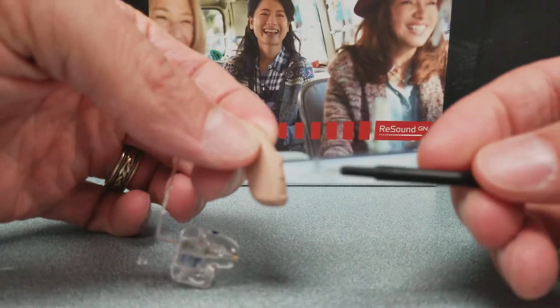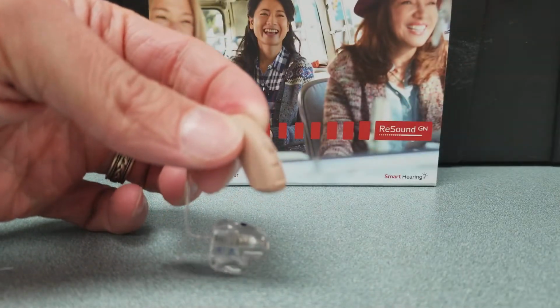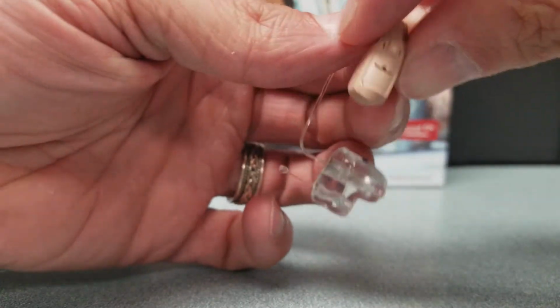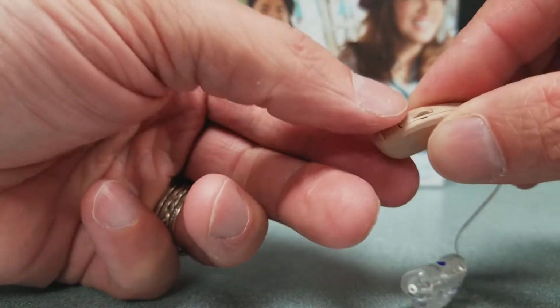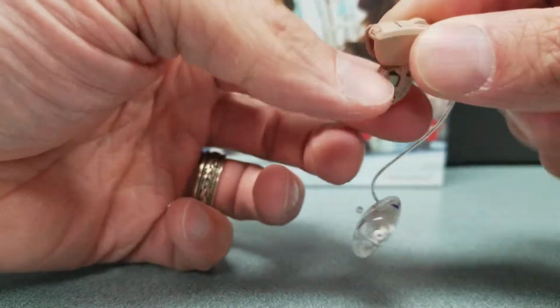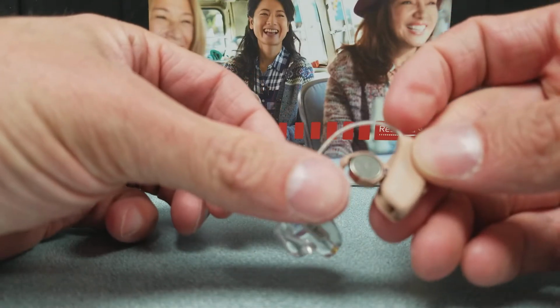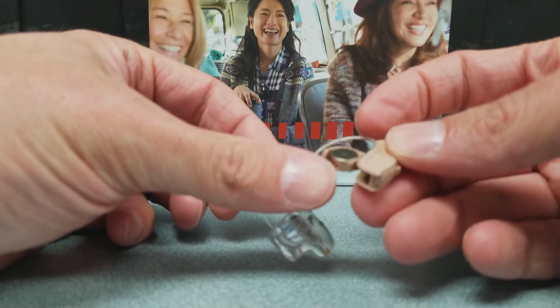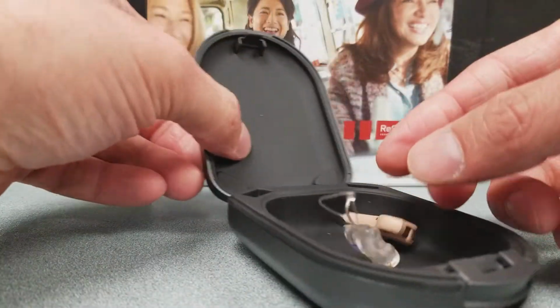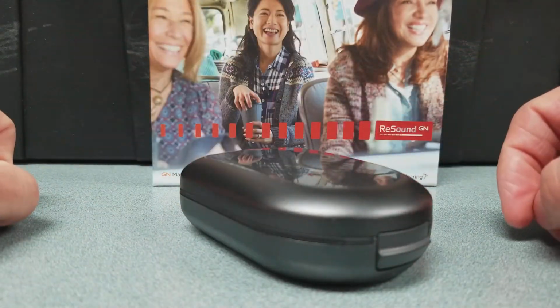This little fin on the bottom here, that is where your battery compartment door is. To open the battery compartment door, you're going to hold it from the sides. You're then going to put your thumbnail on it and you're going to pull down. This is going to expose your battery. This is how we would like it to be stored inside of your hard case, just like so, and make sure you snap and lock the lid.